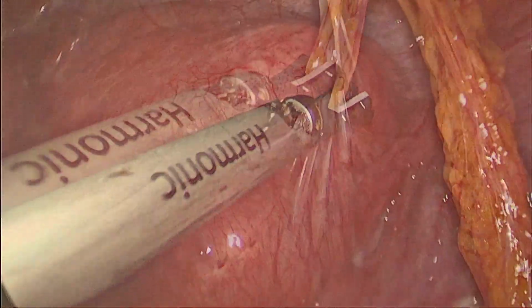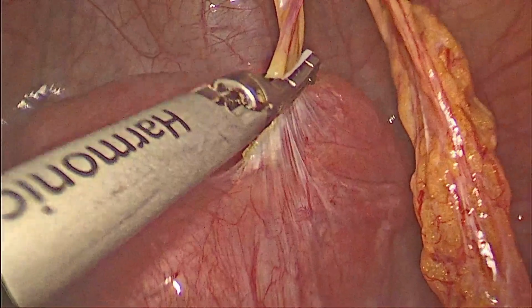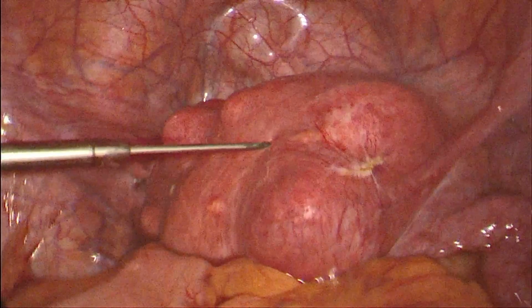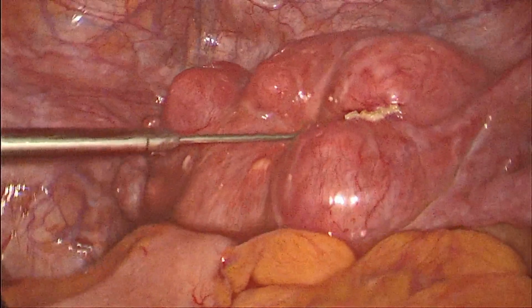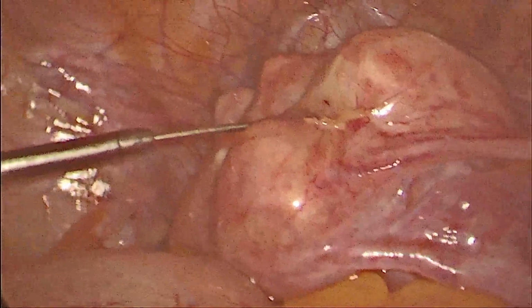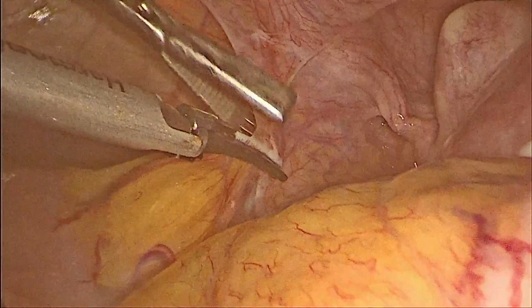The idea of presenting this case is mainly to understand that previous myomectomy would have produced significant adhesions if proper hemostasis is not maintained and approximation of the incised ends was not there. So as routinely, we started the surgery with the vasopressin injection into the uterus in 10% dilution.